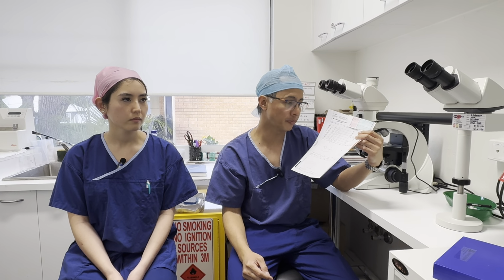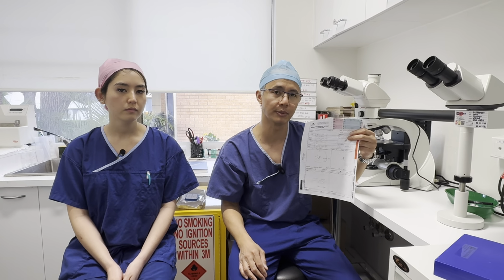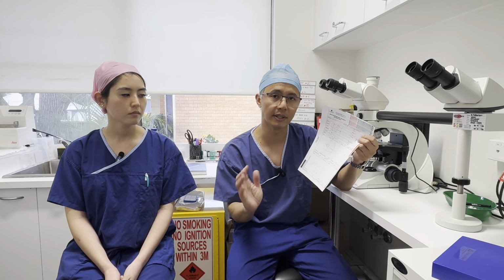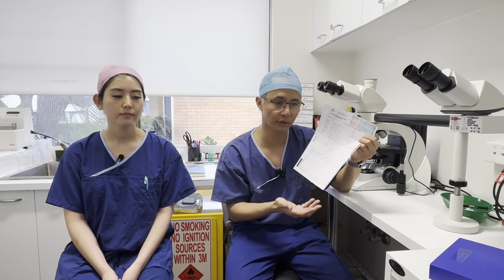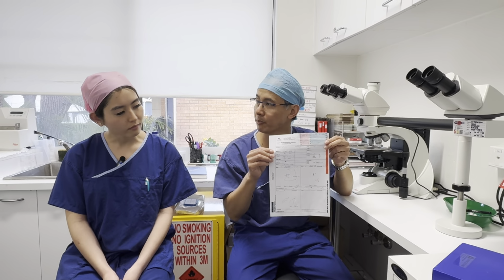Now, MOHS is different to normal surgery or normal pathology because we check all the edges as well as underneath in one slide or 2 slides. So it's a much more thorough look at the edges of the specimen compared to if you might have seen frozen sections done. They are only taking samples of the edge, so they can't look at the whole edge in the one go. So that's this MOHS map in a nutshell, Selena.